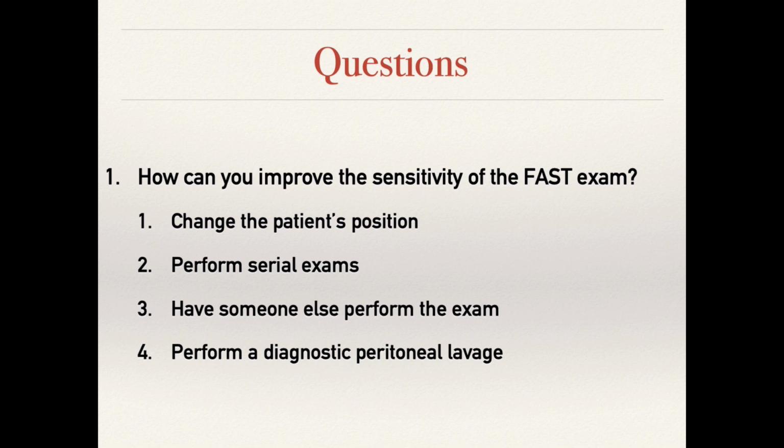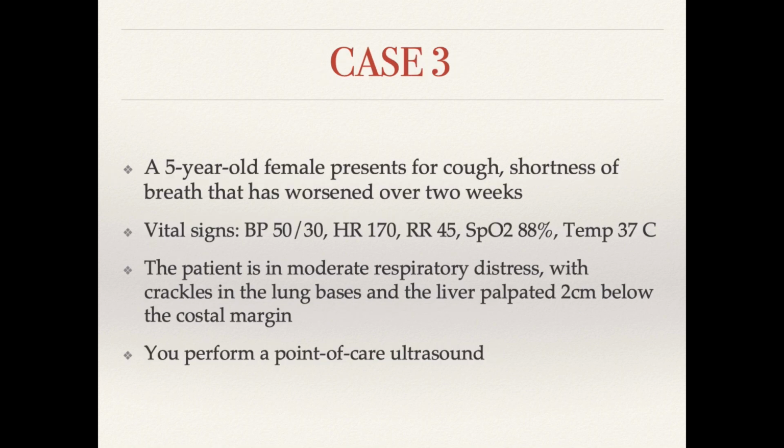You can perform serial exams. This one makes perhaps the most sense. If the patient has a car accident and they present 3 minutes after the accident, FAST may be negative. But if they presented 3 hours after the accident, more likely to be positive. You can have someone else perform the exam. That's true as well. The more experience you have with ultrasound, the better you are. So if you're not getting the windows you like, or you're not really sure, you go and you find someone who is more practiced to do the evaluation. And then 4 is a wrong answer.